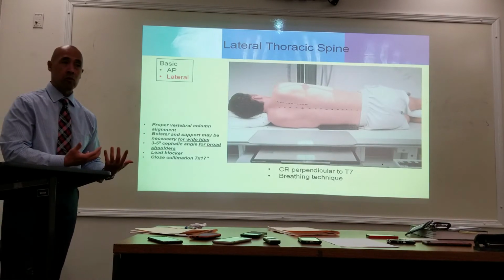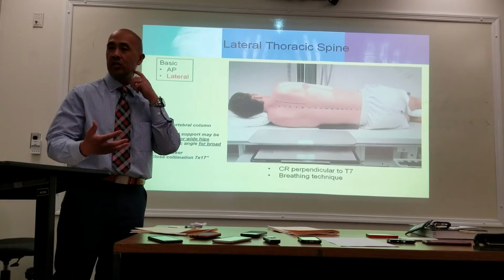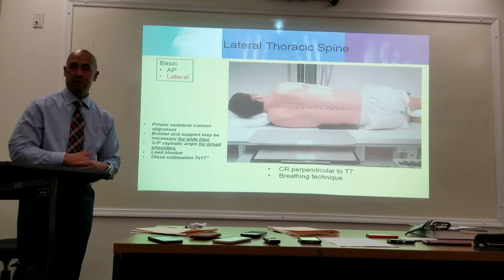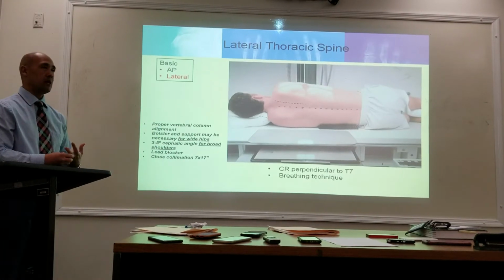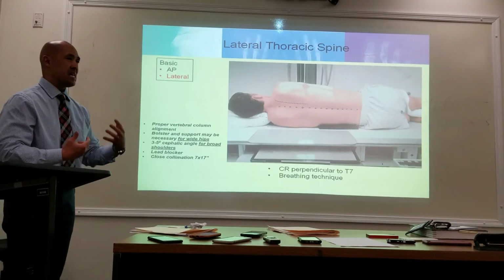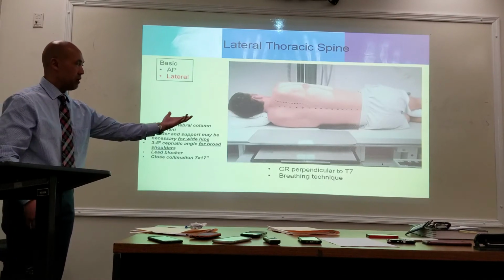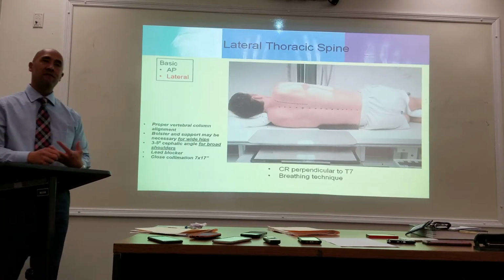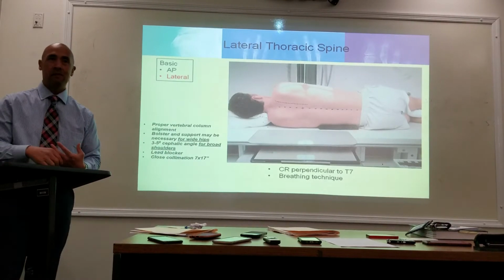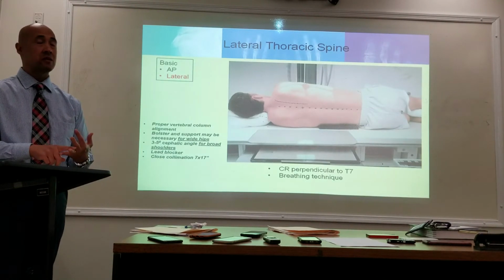We're looking at bone. We're trying to maintain high contrast. So if you have scatter radiation, you're going to lose that high contrast. Now, we've done a study the last couple of years where we tried to see if there was any difference in shooting a very thick anatomical part with and without a lead strip, and we found out that it was very, very minor, because now the DR system and the CR system has gotten so good, it cleans out a majority of that fog.